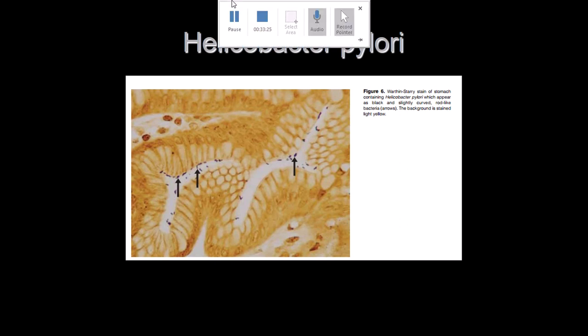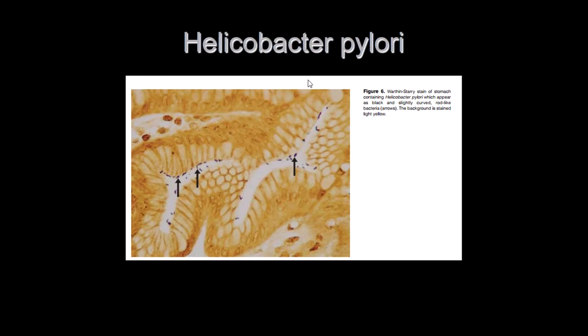This is extremely important to know. So a bacterium that is slightly curved, taken from the wall of the stomach, has to be thought of as Helicobacter, and if it is urease enzyme positive, you can confirm the diagnosis, as simple as that.